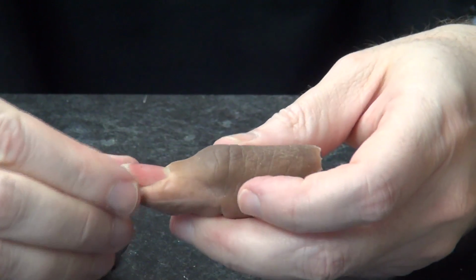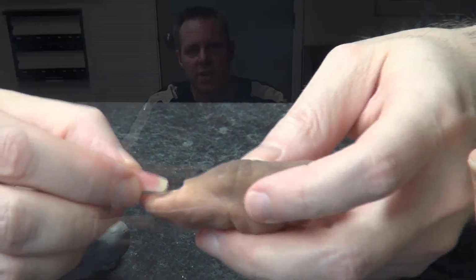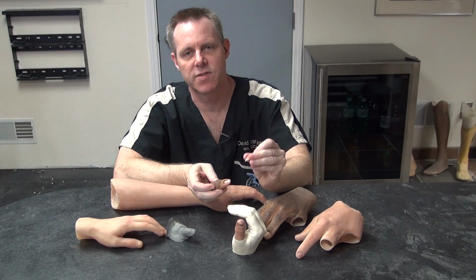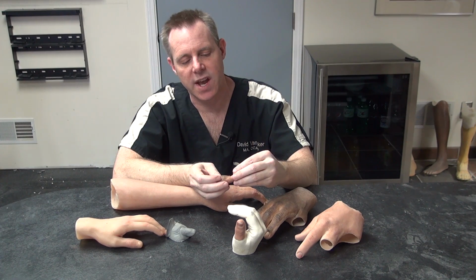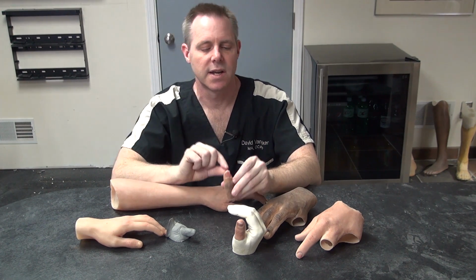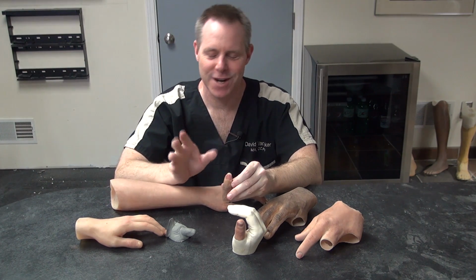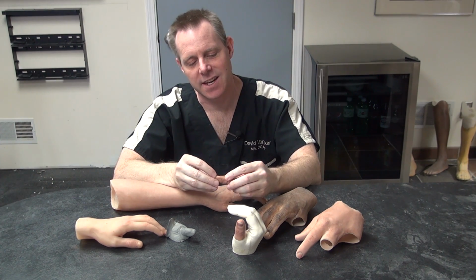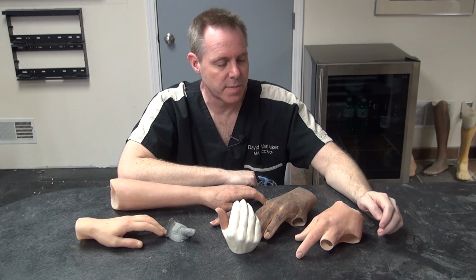And then here's a separate nail that we fabricated that we would end up gluing in place so that you can see that it's a separate piece. It's actually a physical separate piece that we create that's designed to match the patient in every detail. And even for the ladies, sometimes they'll do French nails or whatever like that they require. But that's a summary of partial hands and upper extremities.